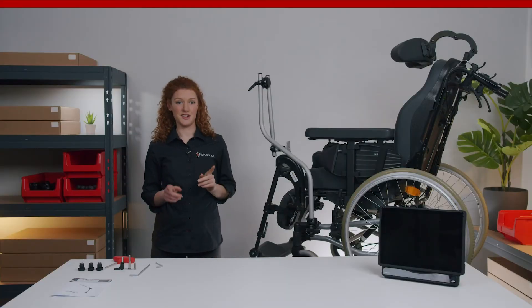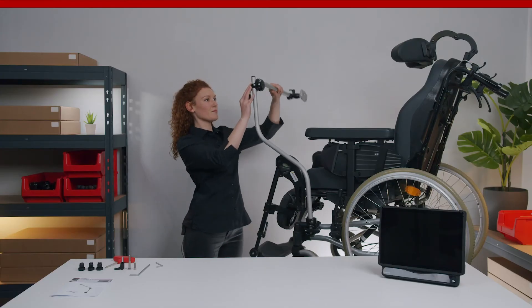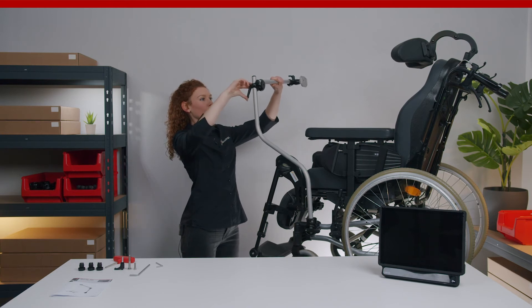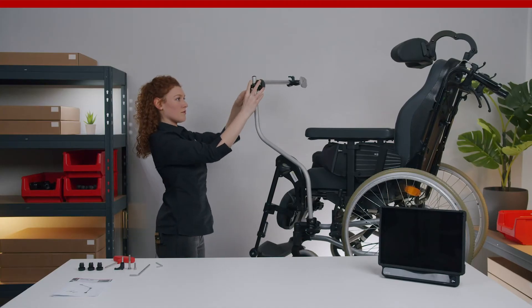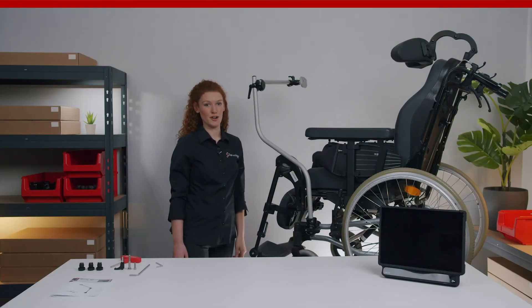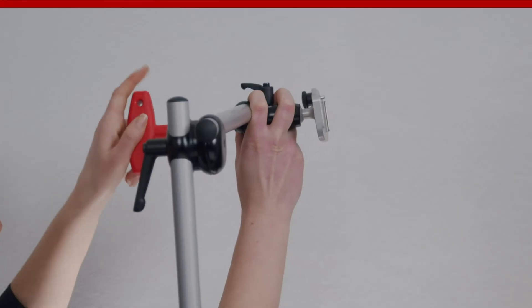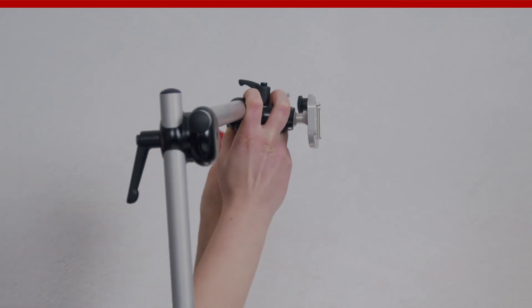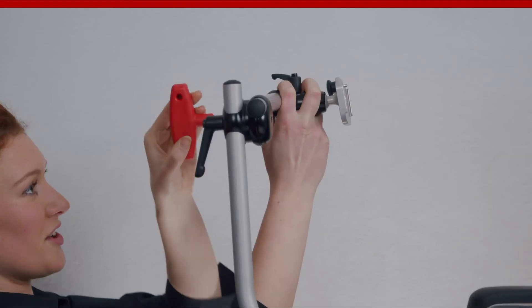The next step is the adjustment of the universal joint and the horizontal tube. Now adjust the horizontal tube at the ideal angle for the beneficiary. Make sure that the lever is aligned with the tube. Now adjust the UDS-DC at the end of the horizontal tube — therefore you need the red T-handle. Now you can align it along the tube. Make sure to tighten it again.